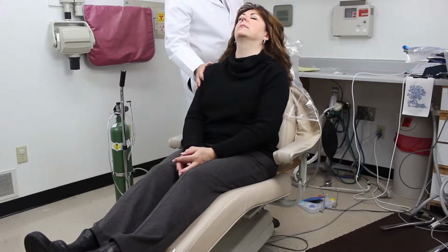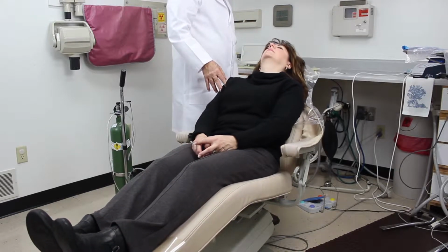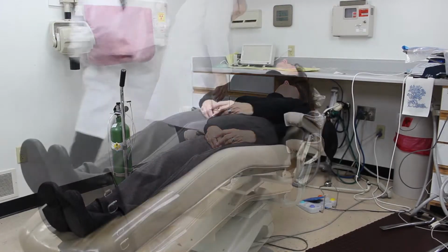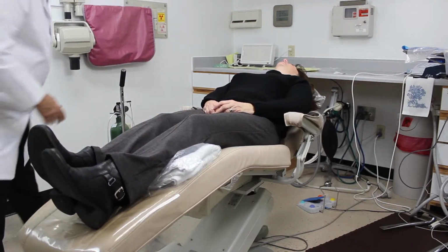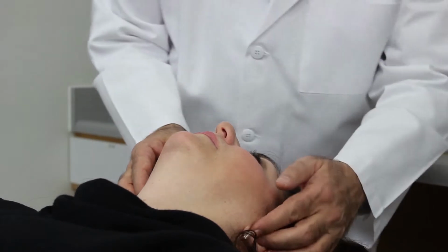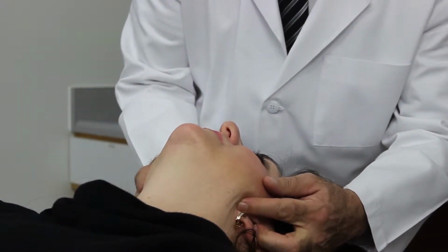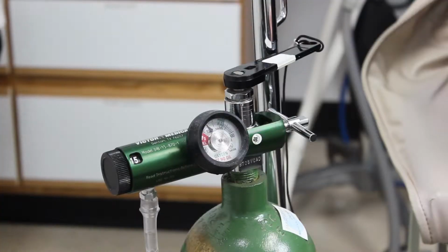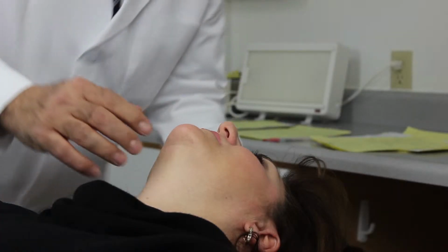Let's go ahead to the live demonstration. Verify the patient's unresponsiveness. Place the patient in the supine position with the legs elevated. Put towels under the legs. Don't tip them back too far. Do a head tilt, chin lift maneuver, and a jaw thrust maneuver if needed to move the tongue away from the pharynx and open the airway. Oxygen therapy with the non-rebreathing mask is in place. Look, listen, and feel.